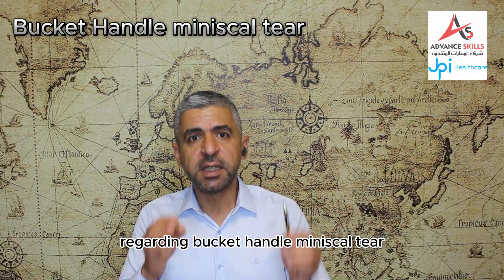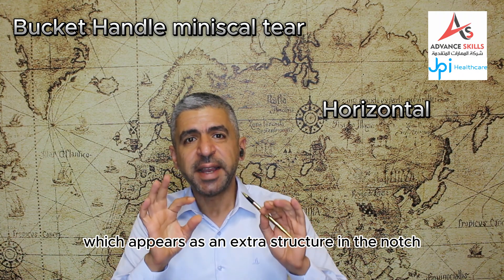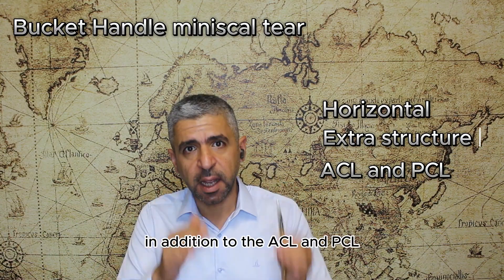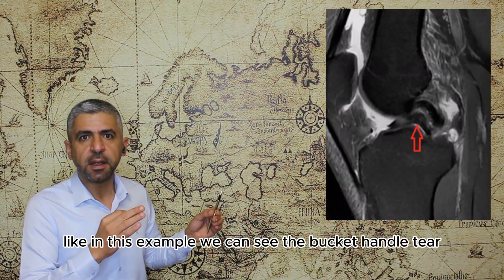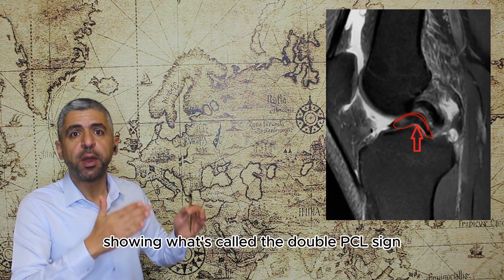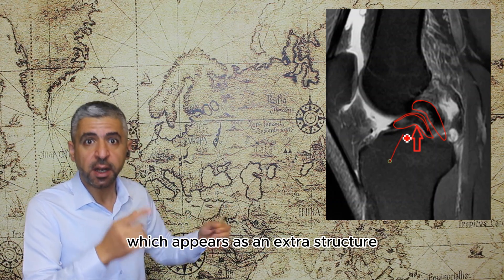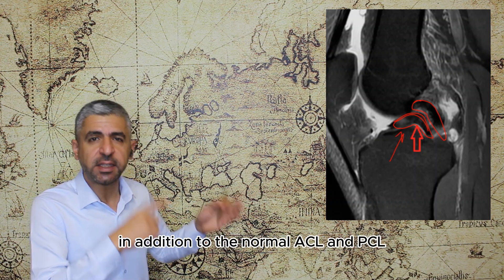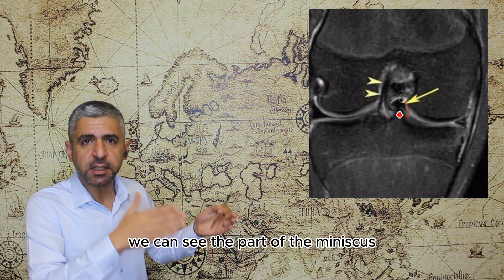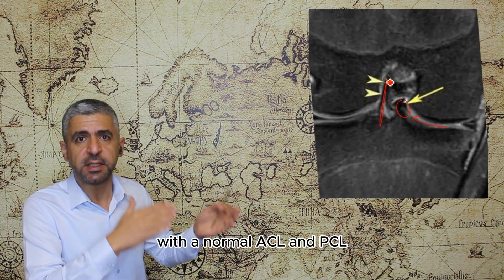Bucket handle meniscal tear will show a horizontally oriented fragment appearing as an extra structure in the notch in addition to the ACL and PCL — the double PCL sign. On this example, the flipped meniscus shows the double PCL sign. On the coronal image, the flipped meniscal fragment in the intercondylar fossa is visible alongside a normal ACL and PCL.